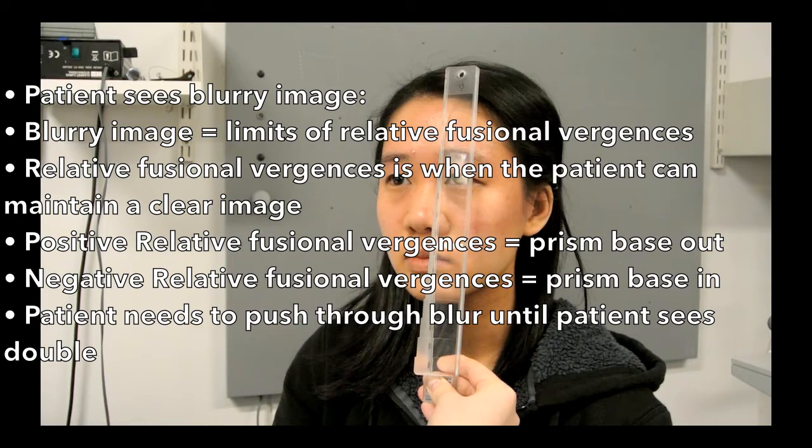The patient continues to fuse the images with some ease as the orthoptist increases the strength of the prisms. At some point the image becomes blurry, and this is when the patient has met the limits of their relative fusional vergences — when the patient can maintain a clear image. Positive relative fusional vergences are assessed with base out prisms, and negative relative fusional vergences with base in prisms. Since this assessment is focused on fusional vergences rather than relative fusional vergences, we can push through blur and determine when the patient is seeing double, then back to seeing single again.